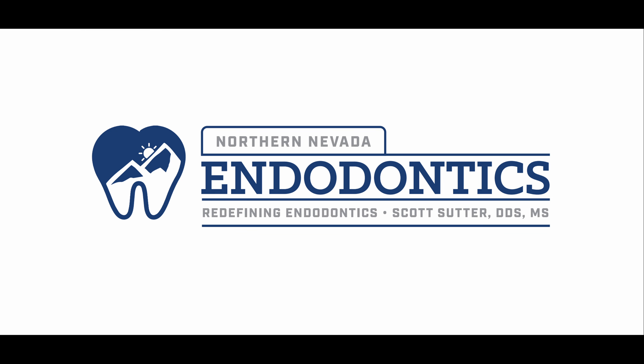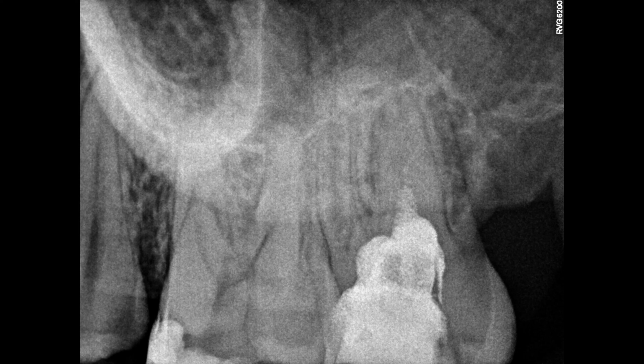Hello everyone, and welcome back. We're back to clinical cases. I know we've had a brief distraction from all the other things, but this is how this patient presented to me. Does anyone know what the heck is inside there?